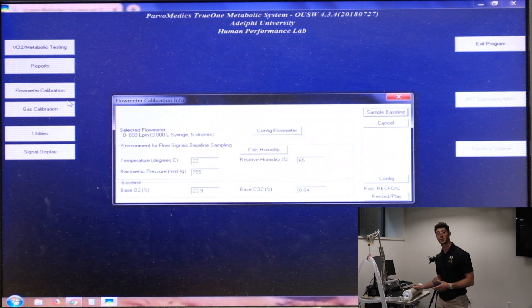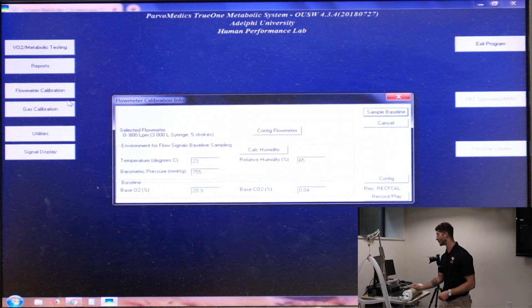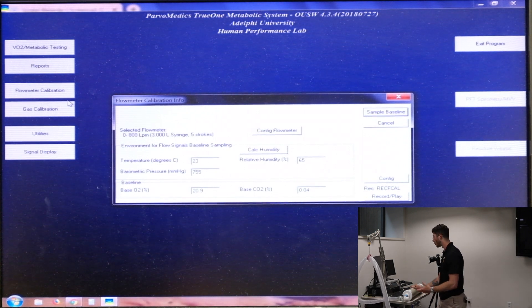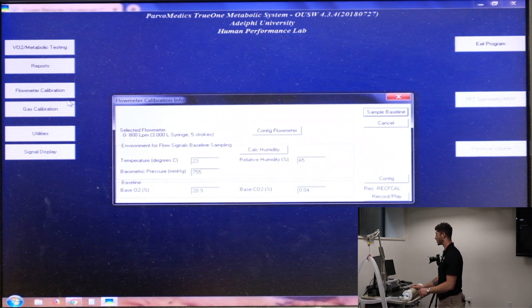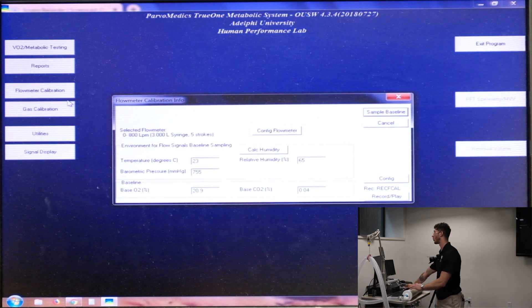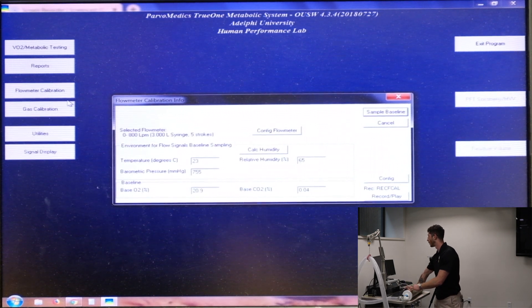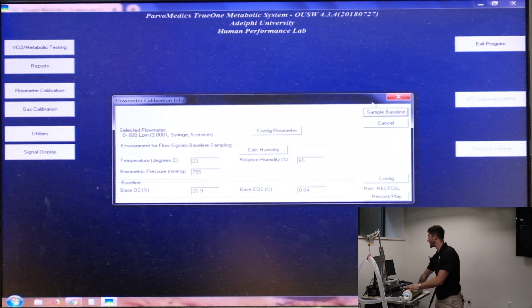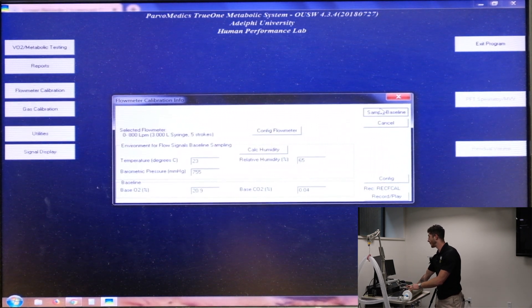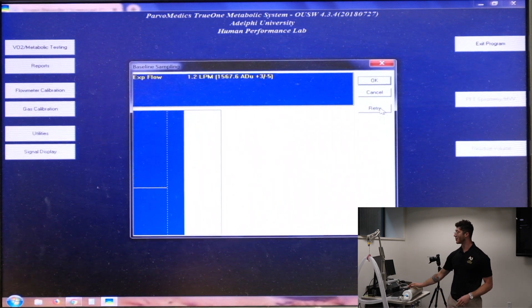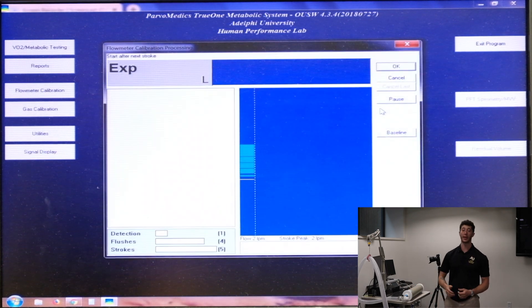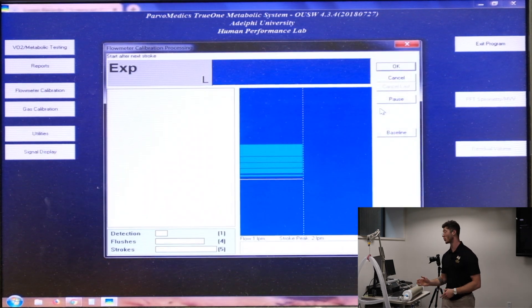Once again, it's going to ask us for the environmental variables, all of which haven't changed. So we don't have to adjust those. We'll hit sample baseline. And this will bring us to our calibration screen.